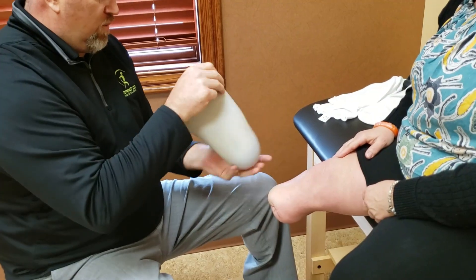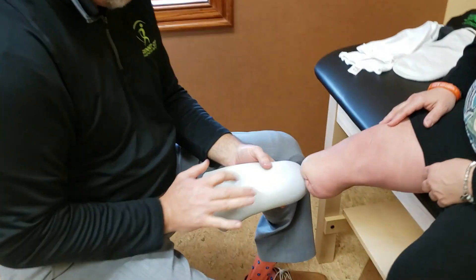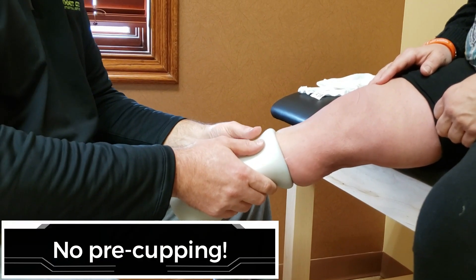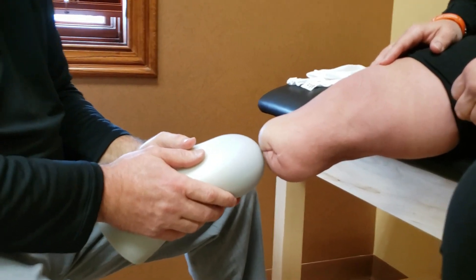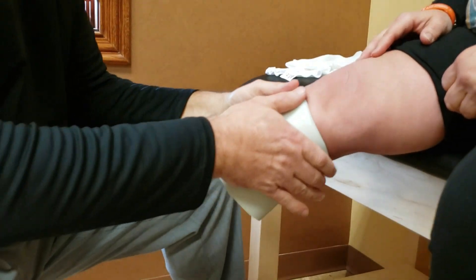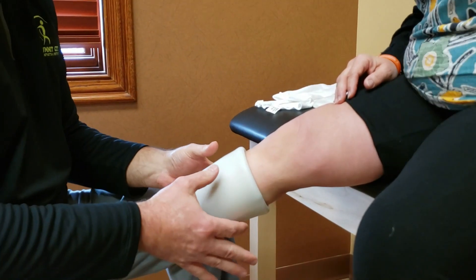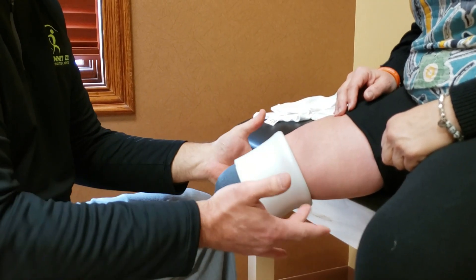We want to invert it and know where the writing is. I always grab the thick side — that's where I orient it. One of the most important things: avoid pre-cupping the liner slightly inverted. Really work on having good contact with the bottom of the liner to the limb as you start to roll it on. It's really about the fingertips and the back of the hand. Using your whole hand can start a wrinkle, so use your fingertips and thumbs rolling on in a consistent fashion.